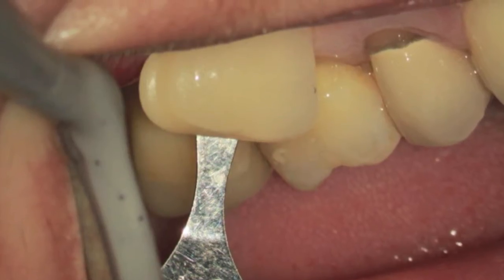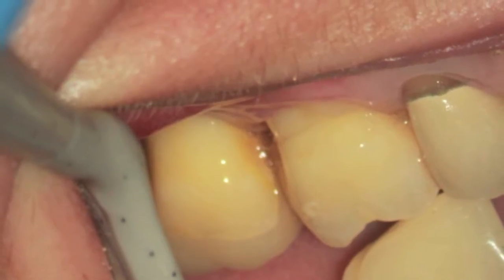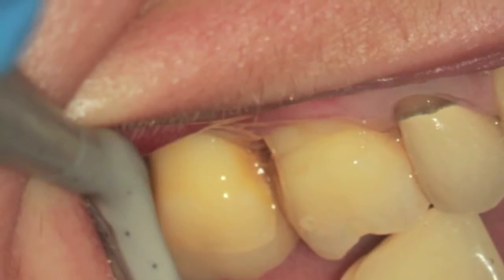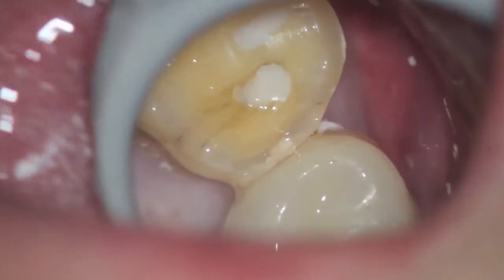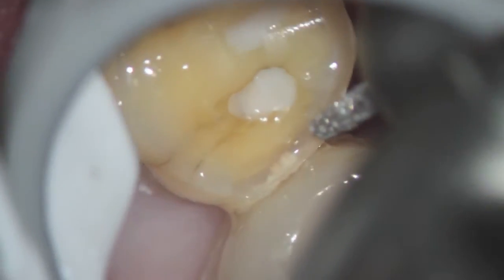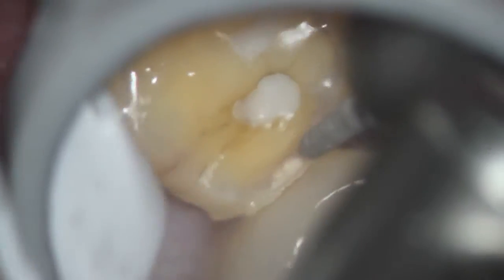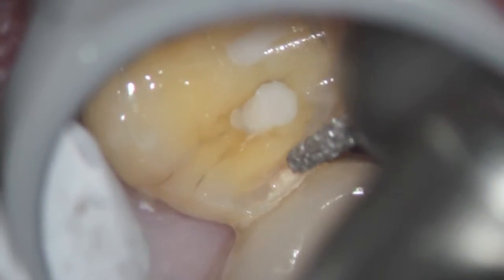This is tooth number three and we're doing a zirconium onlay. The tooth behind tooth number two has had an Emax or lithium disilicate onlay. The difference is that you don't need to remove as much tooth structure with a zirconium, and they are very retentive and very difficult to get off as a matter of fact.